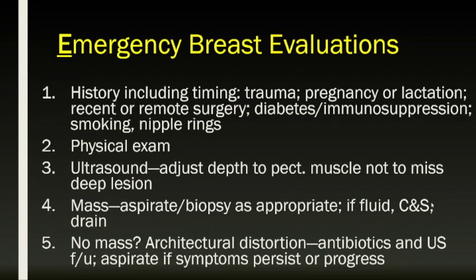And try to do a physical exam, and there you'll see just how acute the problem is by how close the patient lets you come. So masses, no masses, whatever you find from the ultrasound examination will guide you towards the appropriate therapy.